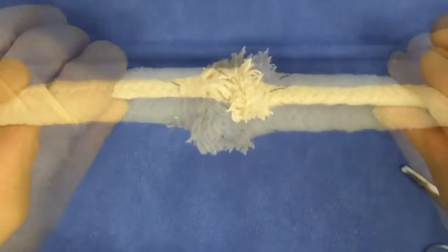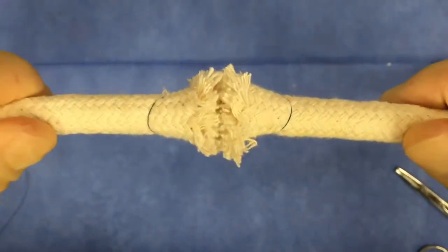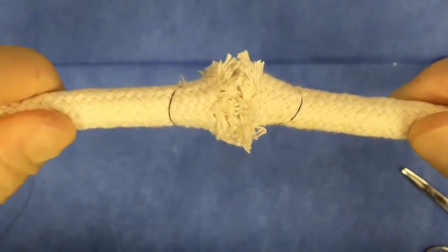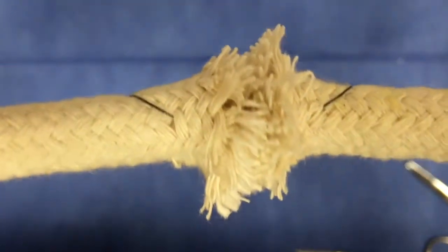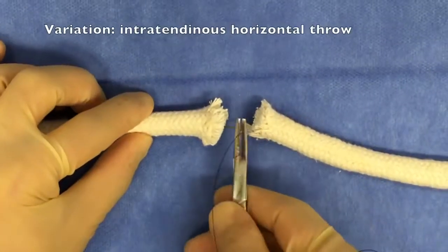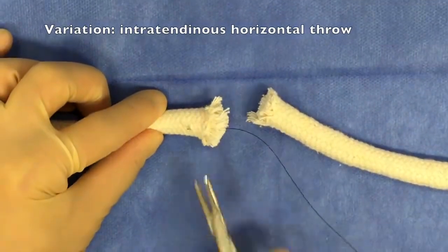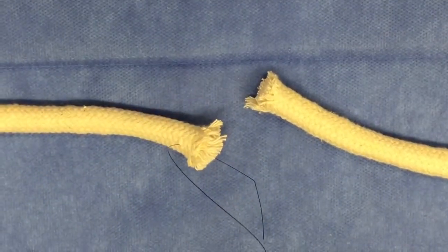When performed correctly, this grasping suture will provide additional strength that you don't get with a simple interrupted suture, which actually squeezes those fibers of the tendon together and adds more tensile strength for the healing of that tendon. So as I said, there are a lot of variations on this same technique. Let me show you one variation that's commonly used in the literature.